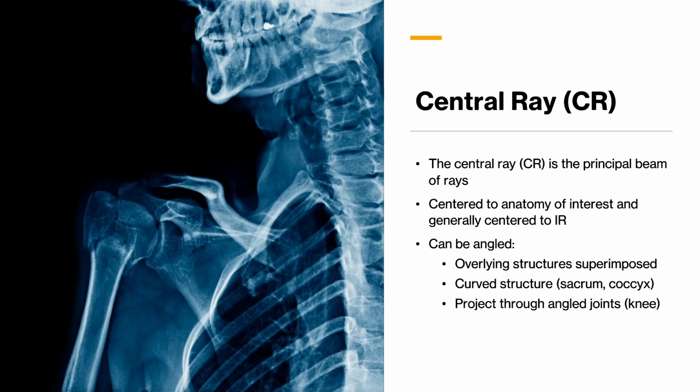So the central ray is our principal beam of rays, where that radiation is going to be targeted. It'll be centered to the anatomy of interest, and generally centered to the imaging receptor.